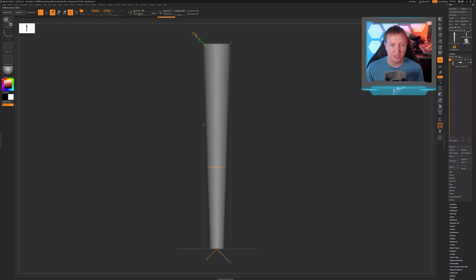And the next thing I want to do is widen it out near the base. So I'm going to fatten this one out just a little bit here so that that can provide that little bit of compression. And then let me drop back down here and maybe make these just a hair narrower. All right, that looks good. Okay, so that's going to be the shaft of our screw. And then the next thing I want to do is make the threads of the screw.